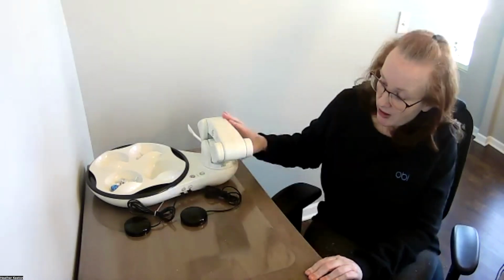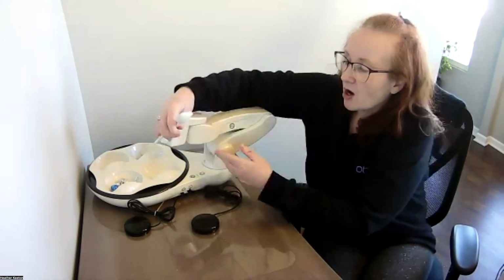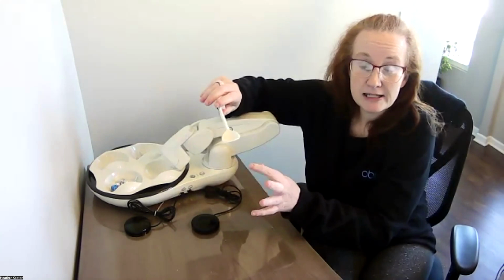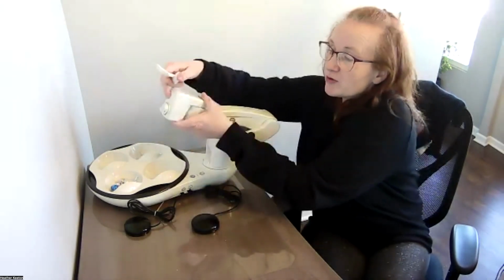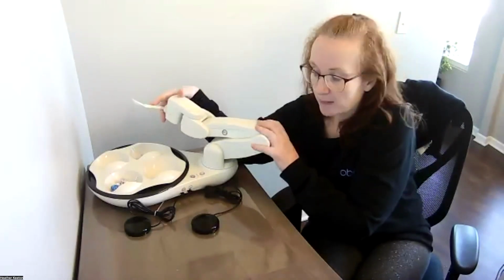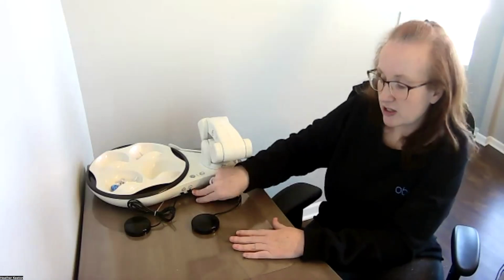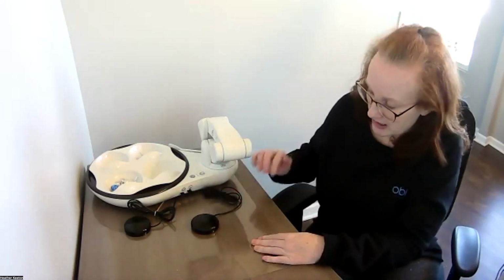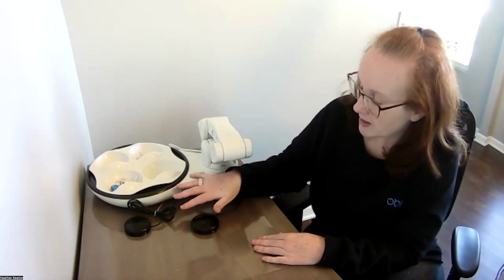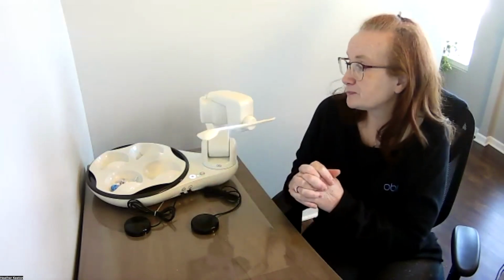Beautiful. So as you guys can see, I have Obi here with buttons, pressure switches, or buddy buttons, if you will. Obi's spoon is held on by a magnet. This is a safety feature, so that way if someone does have severe spasticity or muscle clenching, they're not pulling the robot off or choking themselves. The switches just plug into the front. I do not have this plugged into the wall, so it is on its battery. Powering the device on, you simply press the power button. Obi will come around and give you a bow.